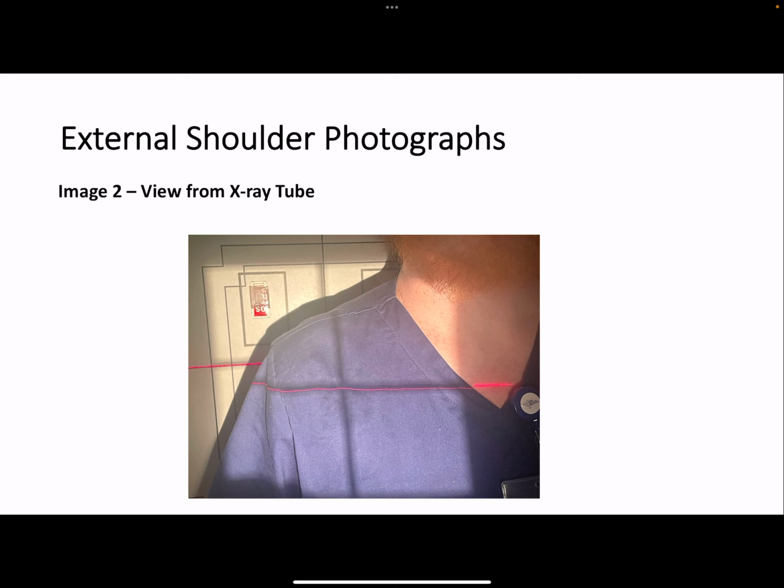The marker is placed just outside the shoulder, close enough to view but not to impede on any bone structure in the picture. In this case, the anatomy of interest is the right shoulder. The kVp range for the patient is 70 to 85 kVp. The instructions to the patient were: hold still, stop breathing. I then took the picture and told him to breathe again.